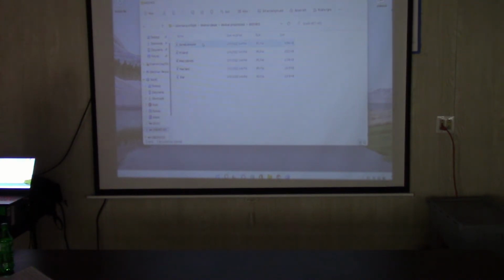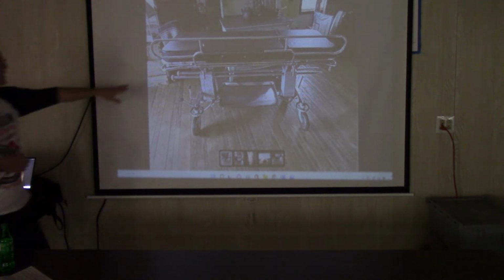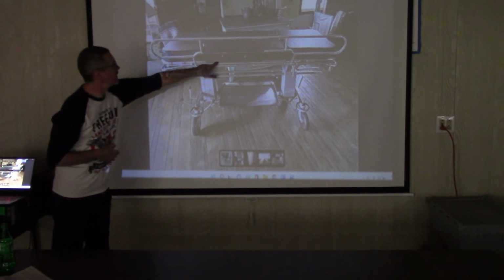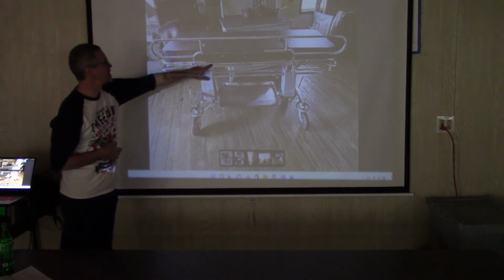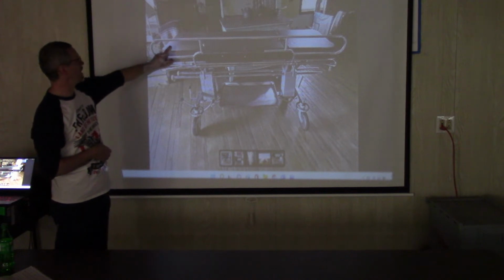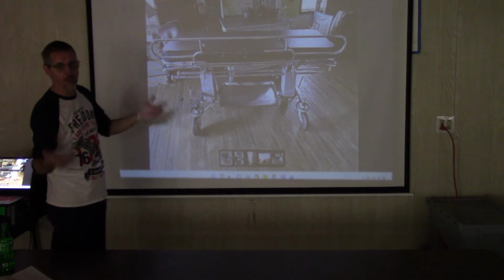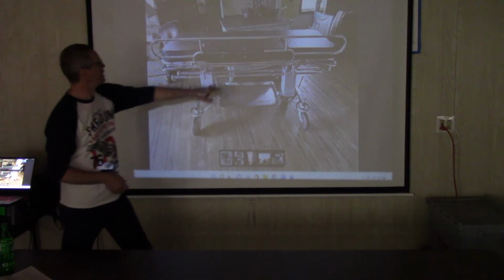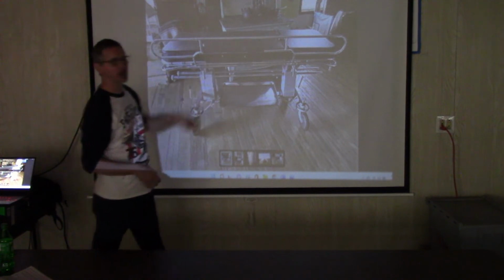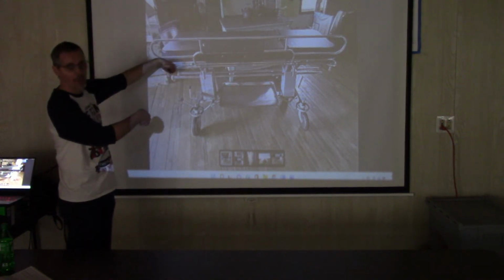Speaking of not usual stuff, we just picked up the medical bed that we can put in the clinic. So it's a bed stretcher. This aluminum ring that goes underneath the mattress pops off the bed. It's got a hook at each end, so you can take the pad and this part off, take it out in the field. If somebody's injured, get them on there. We do need to get one more strap for this end to strap the person down, but then you can bring them back in and put the stretcher directly on the bed.